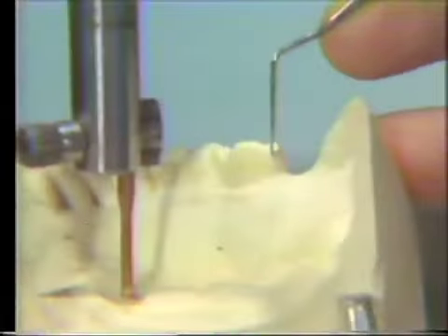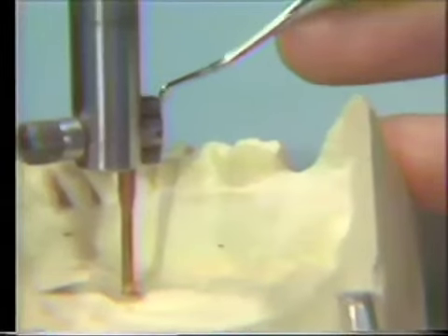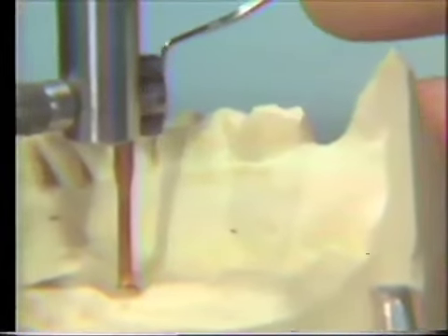The molar abutment tooth looks like it can be restored without greatly over-contouring to get by any undercuts on the abutment tooth. The potential indirect retainer position, the first bicuspid on the right side, has a slight undercut, which we can probably block out to get around very nicely.